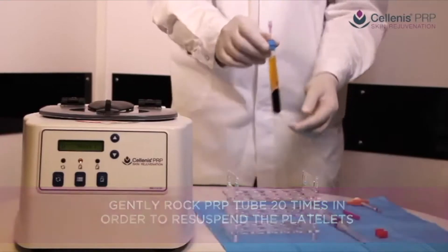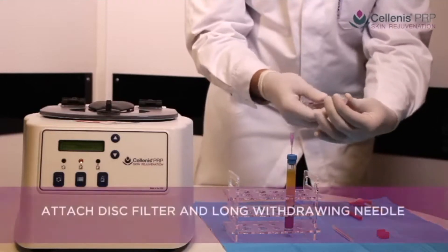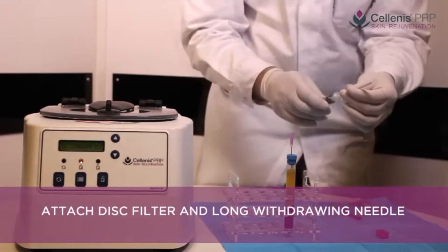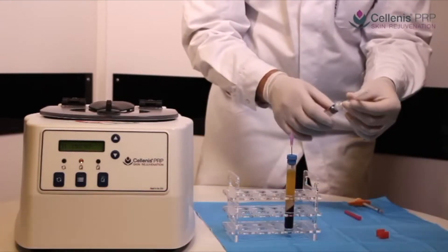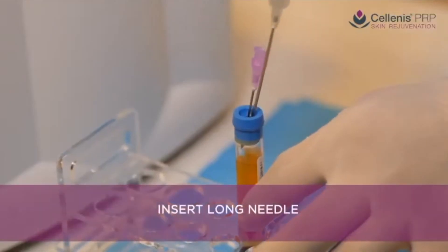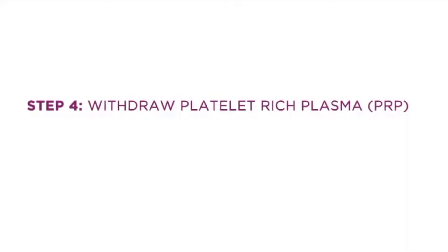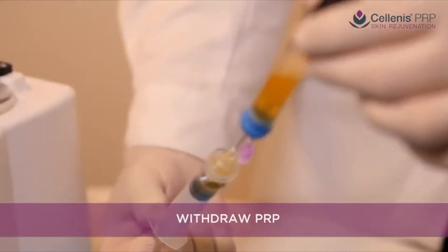The disc filter, with its special pore size, is attached to the syringe and then to the long, sharp needle. The disc filter ensures additional removal of unwanted granulocytes, while the long needle enables easy removal of PRP without removing the Solanus tube cap. Insert the long needle next to the filter needle and withdraw PRP by either inverting the Solanus tube or holding the tube at an angle to reach all the PRP.